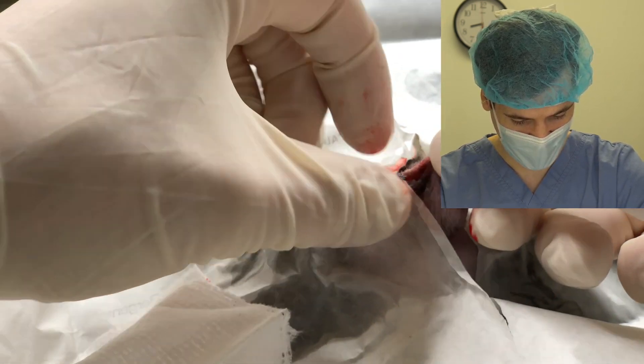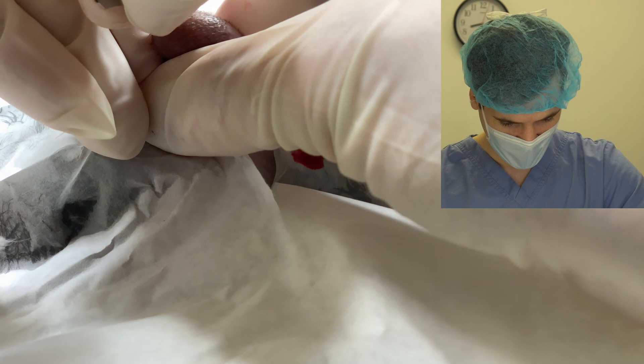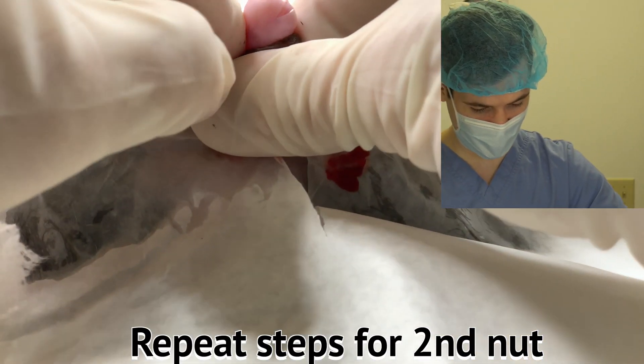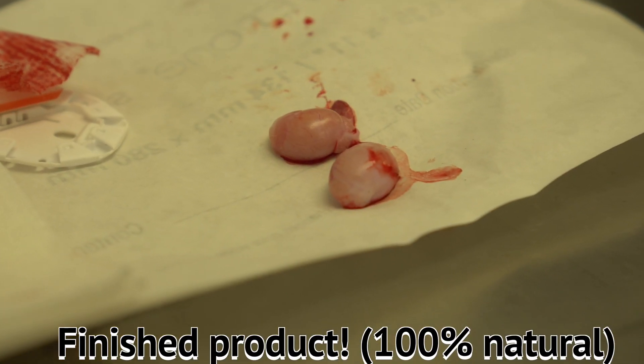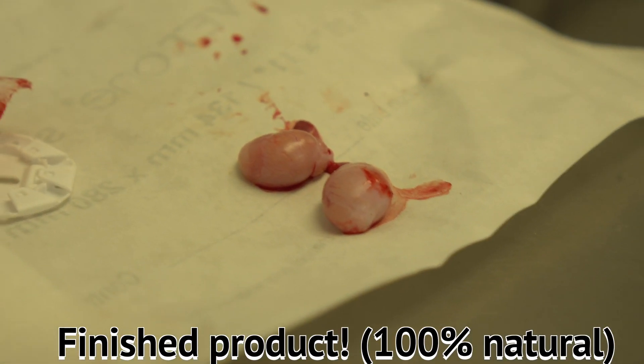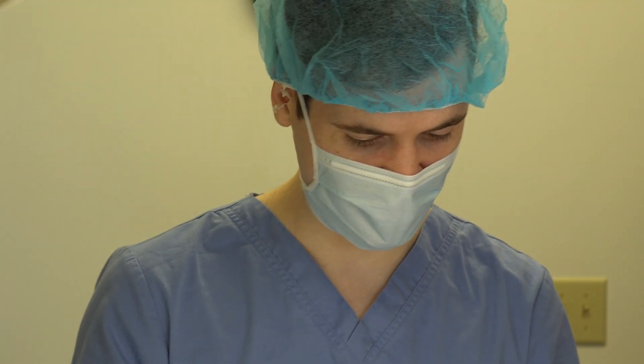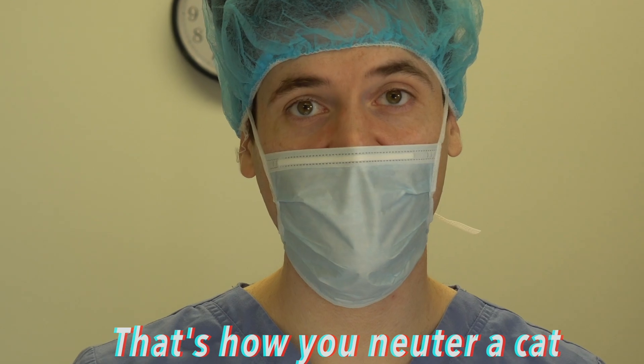No bleeding, and that's pretty much it for that testicle. Now we've got one more to do, so I'll make the second incision on his left testicle. These incision sites are just gonna heal by second intention, so no sutures are needed to close those up. And that's the end of the procedure — that's how you do it.